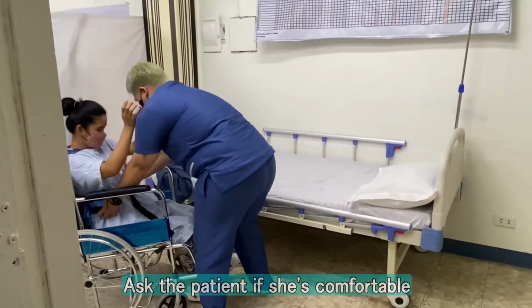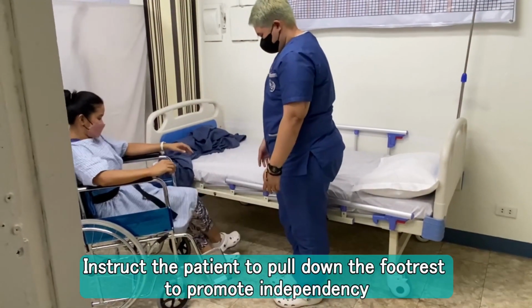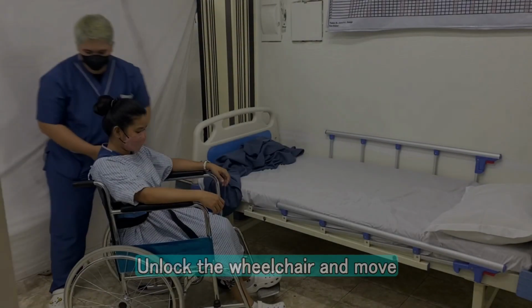Ask the patient if she's comfortable. Instruct the patient to pull down the footrest to promote independence. Unlock the wheelchair and move.